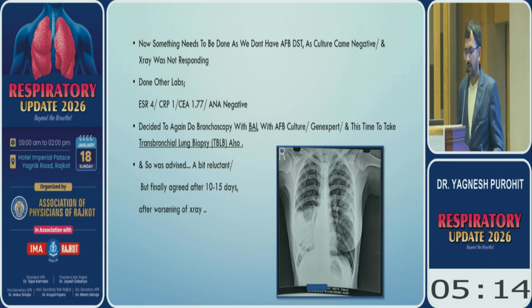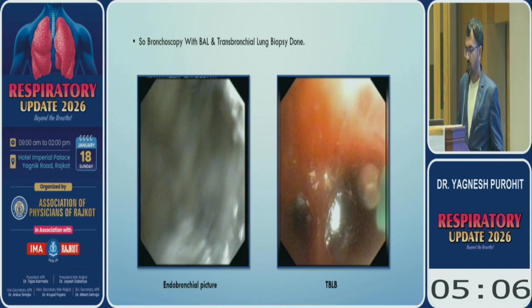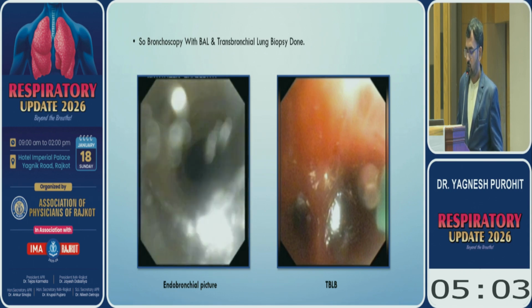He was a bit reluctant, but finally they agreed after 10 to 15 days, after seeing the worsening of this X-ray again. So bronchoscopy with BAL and transbronchial lung biopsy was done. This was her bronchoscopic picture.